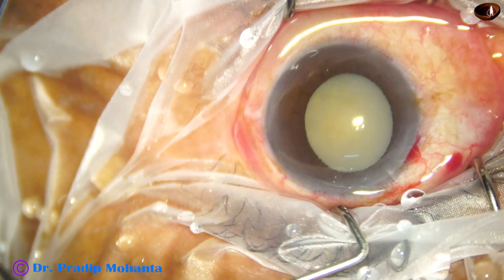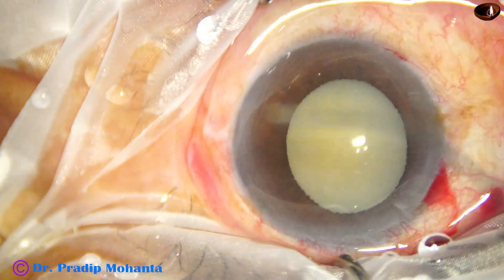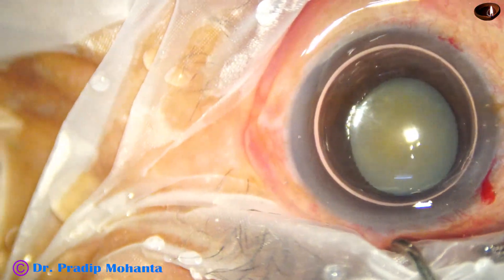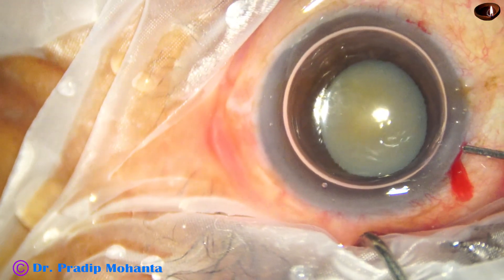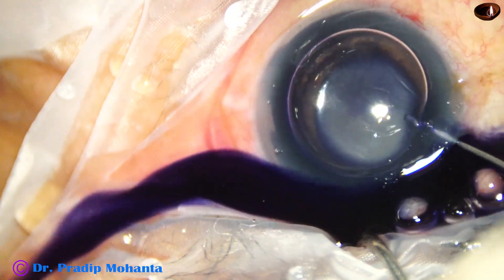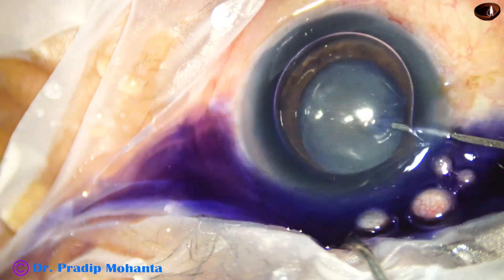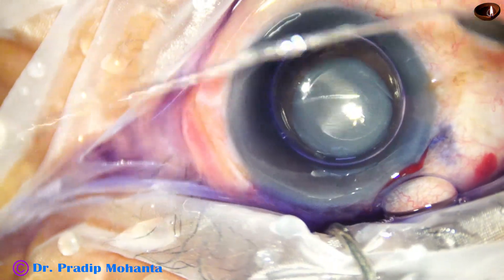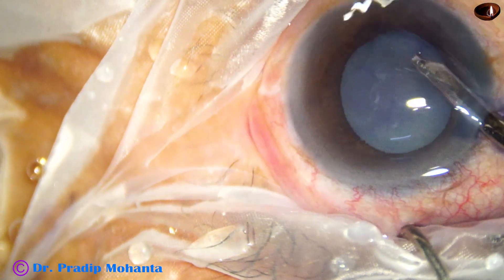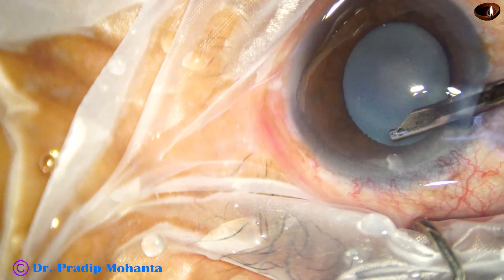Now we have to stain the anterior capsule with trypan blue dye in these cases. So here goes an air bubble. I always use an air bubble and then stain the anterior capsule. The staining is very quick and only a little bit of dye is required. Adrenaline is used to maintain dilatation of the pupil. And then this is lavage of the AC to remove the excess trypan blue dye.